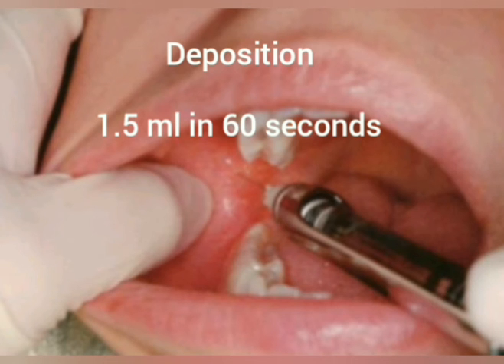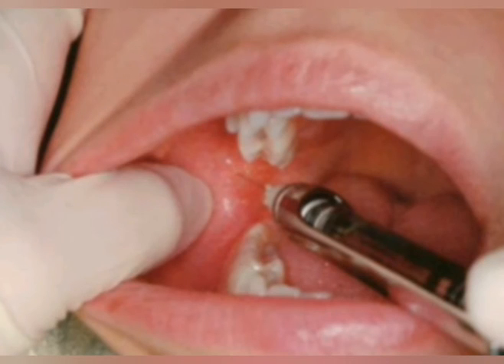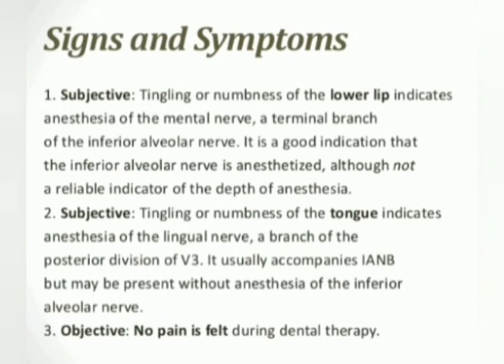1.5 ml of anesthetic solution in 60 seconds is usually recommended. Because of high incidence of positive aspiration, sequence of slow injection, reaspiration is strongly recommended. Signs and symptoms: subjective: tingling or numbness of lower lip indicates anesthesia of mental nerve, a terminal branch of inferior alveolar nerve.